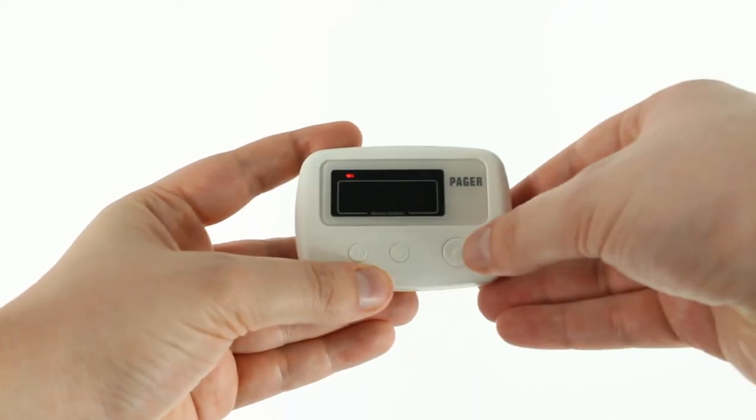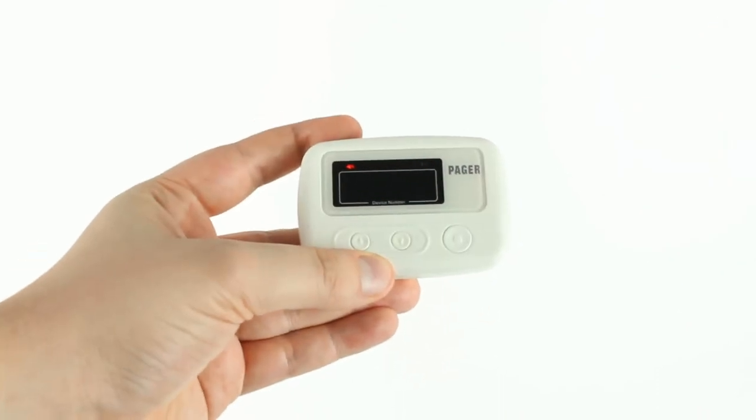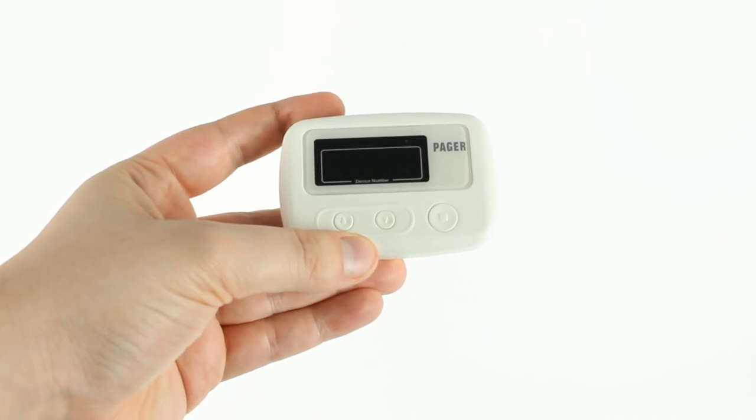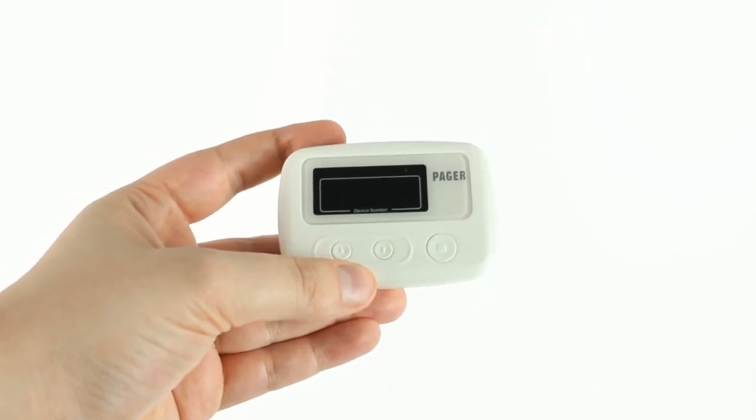If you want to select one, you can either let it time out or press the button. It'll beep if it's in the sound mode to let you know that you've confirmed the setting, and you're all set.